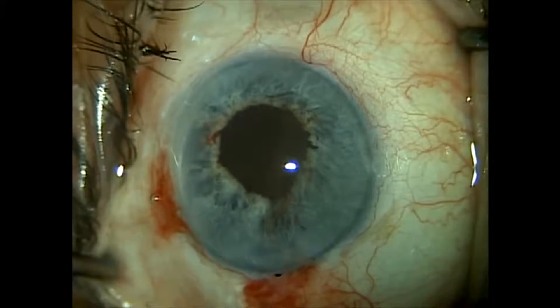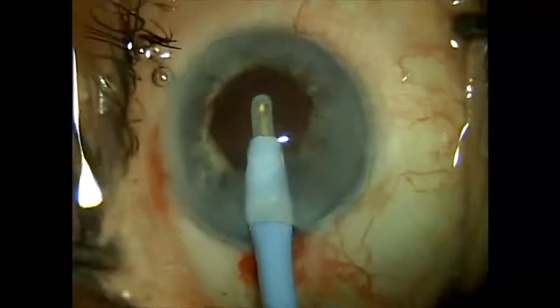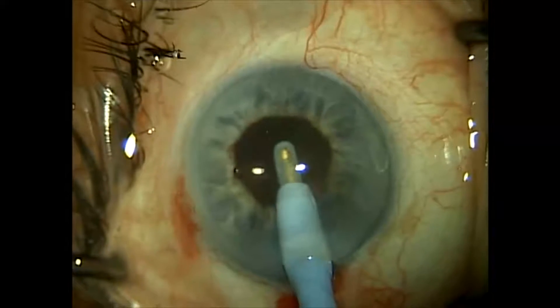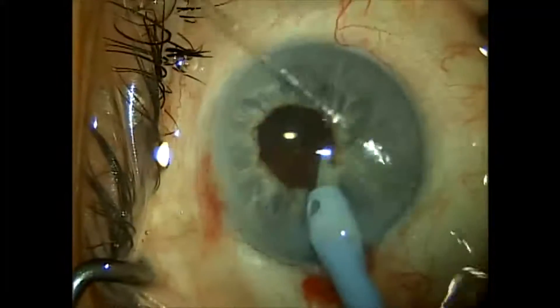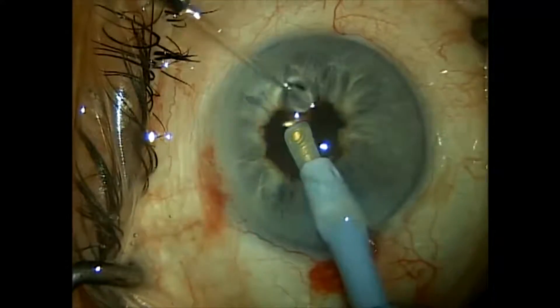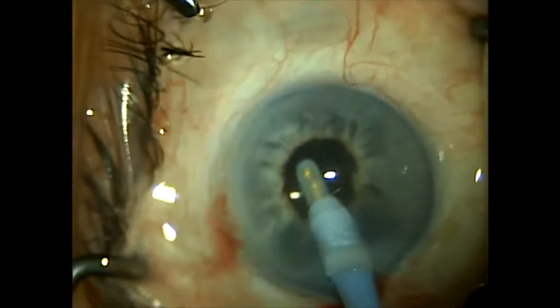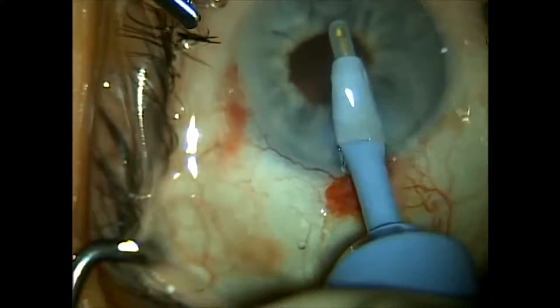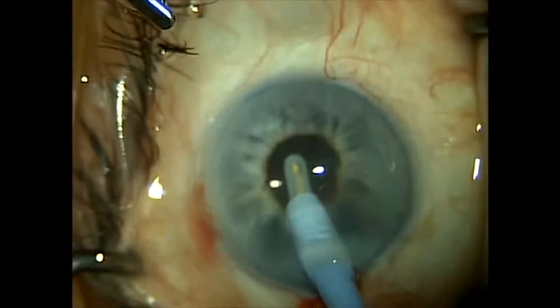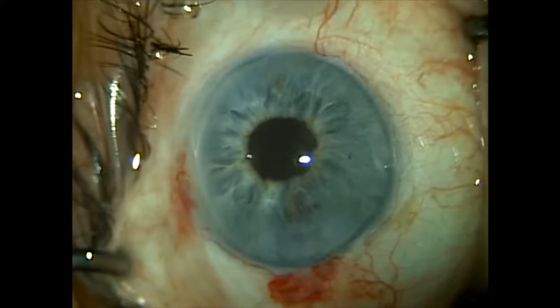Using the Malyugin ring is a much more time-efficient way of pupil expansion. However, it is a more costly way to achieve pupil expansion. Iris retractors can be reused — the Malyugin ring, in my experience, cannot be reused; it is a one-use item. Iris retractors can be re-sterilized and used many times, making iris retractors more cost-effective but more time-intensive.